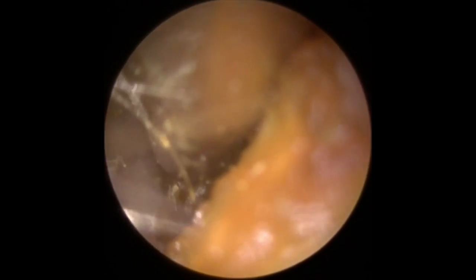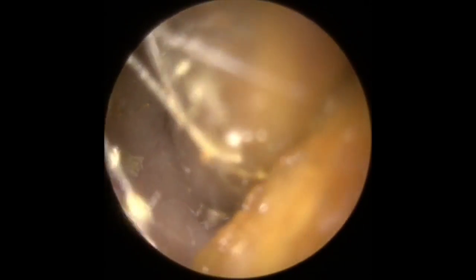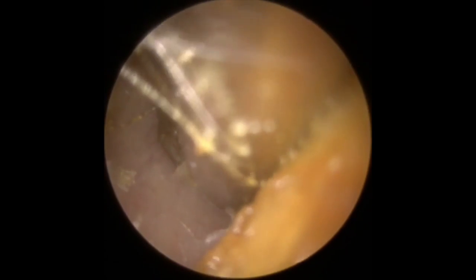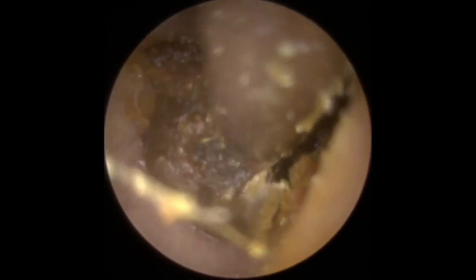So you kind of assess the wax. When you first look in somebody's ear, obviously you only see the outer section of the wax, but you can usually get a good indication of whether you're dealing with soft, hard, or sticky wax at the first look in the ear.